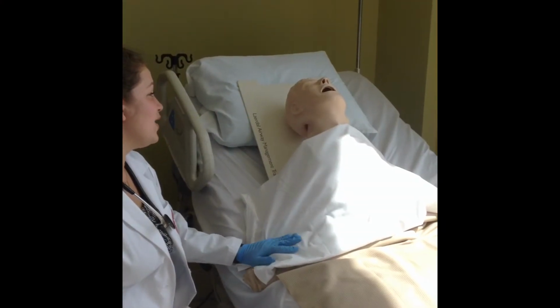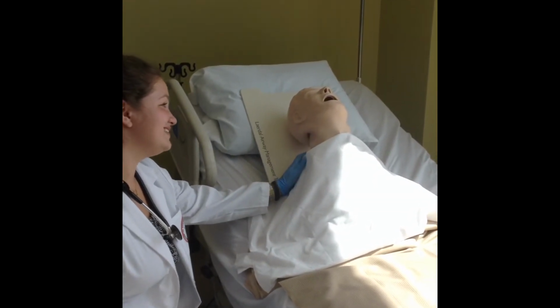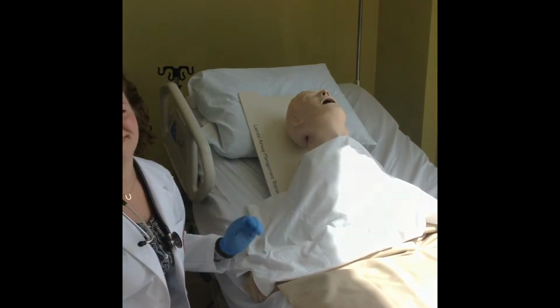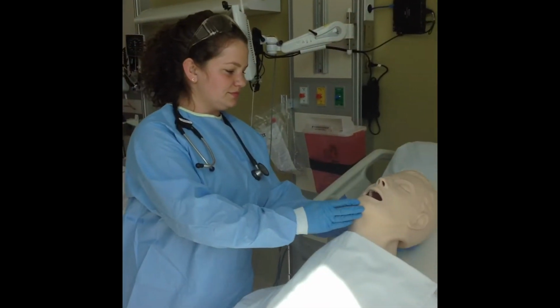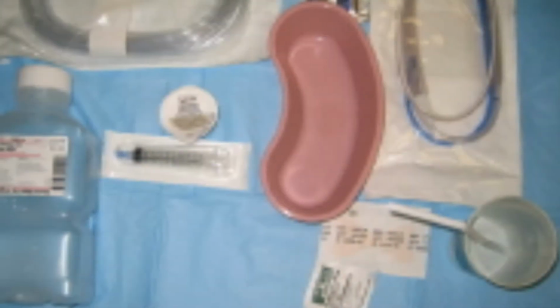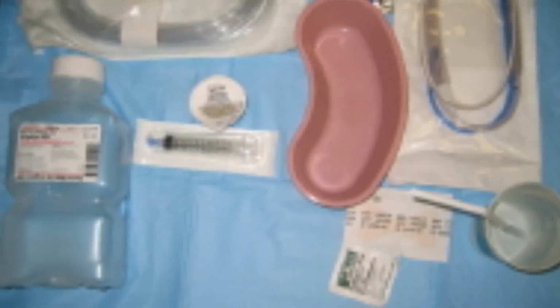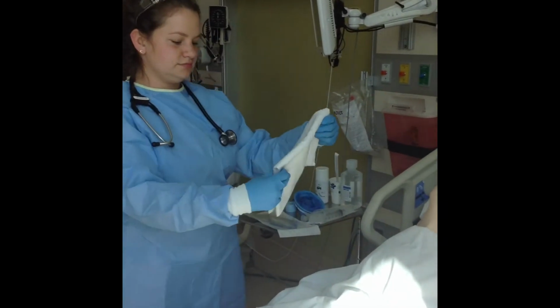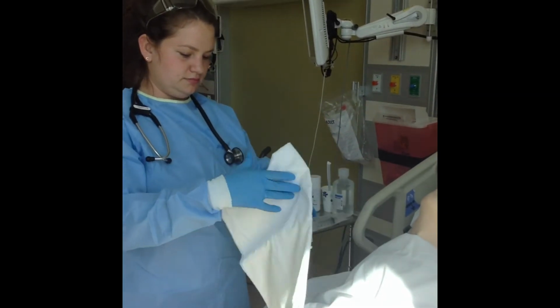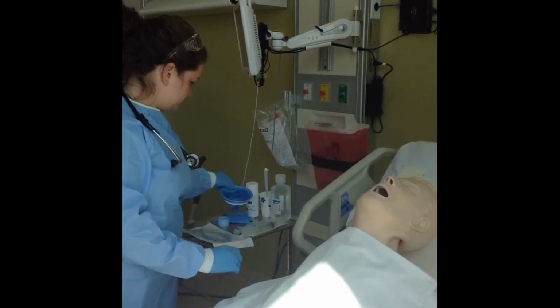Always be sure to discuss any procedure with your patient and answer any questions that they may have before beginning. First, ensure the patient is sitting in a 45-degree angle or greater. Ensure that you have all of your necessary materials and that you've washed your hands and put on your gloves, goggles, and gown. Place a protective sheet in place over the patient's chest and abdomen.